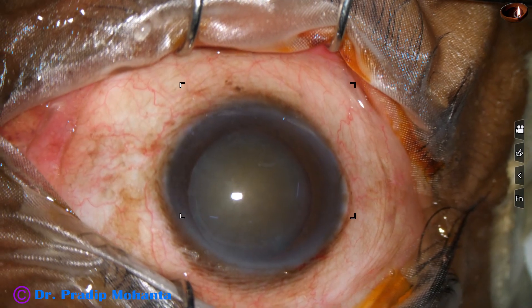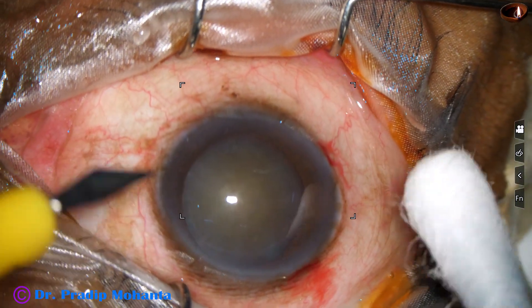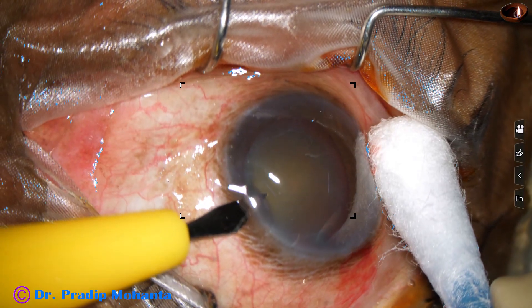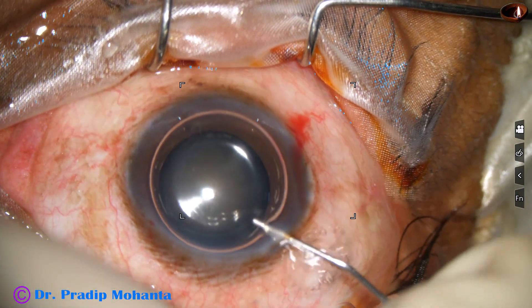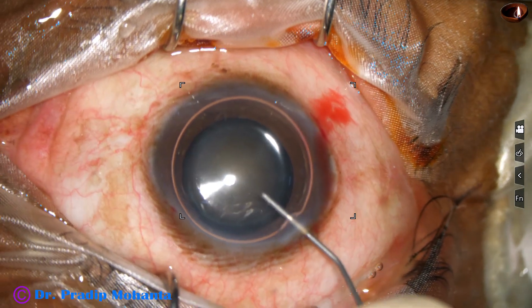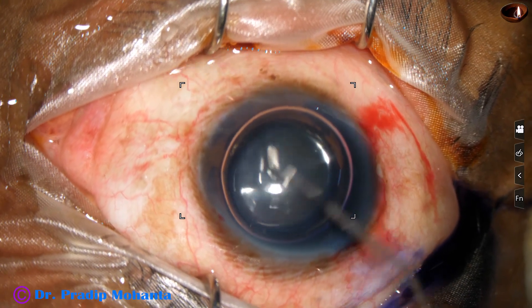This is the main incision after a thorough irrigation of the ocular surface. This is a side port on the right side of the main incision and this is another side port on the left side. The side ports are about three clock hours away from the main incision so that the astigmatism induced by the main incision can be neutralized to some extent by the side ports.